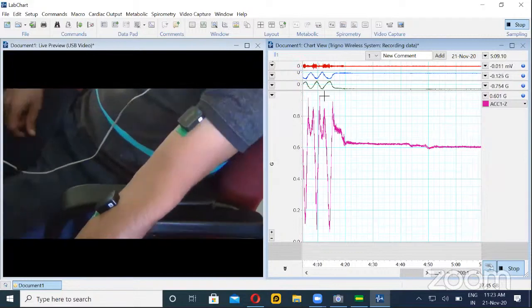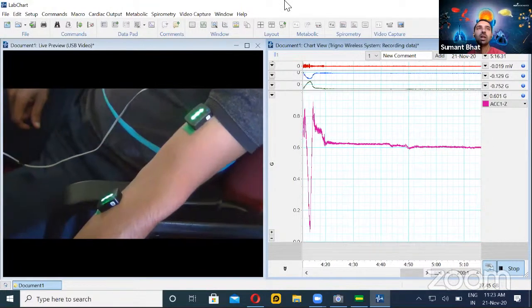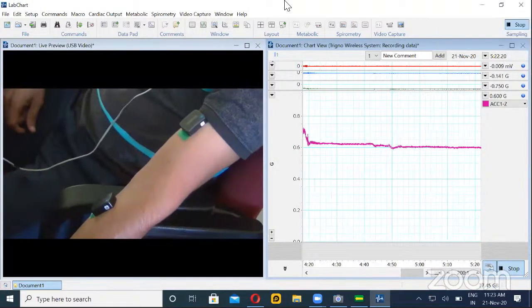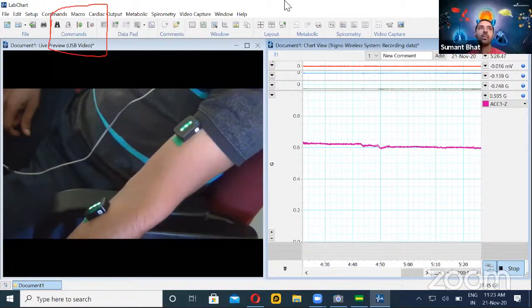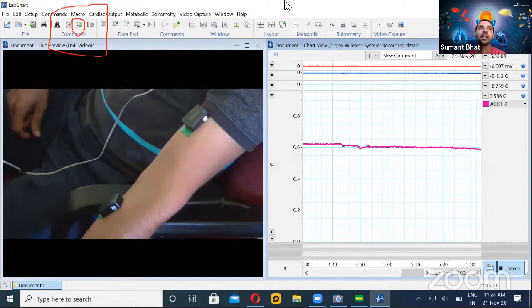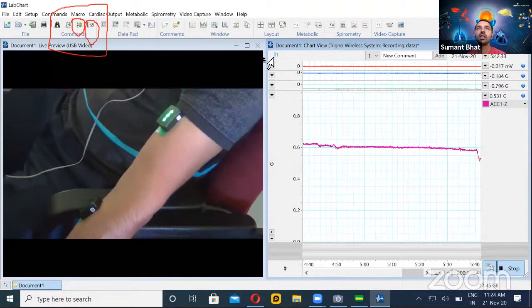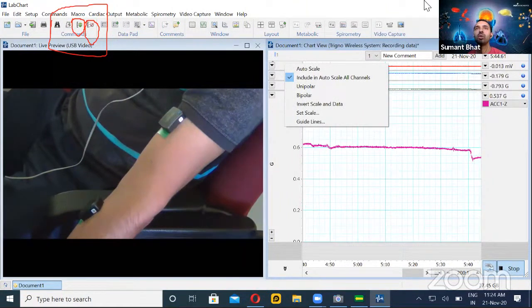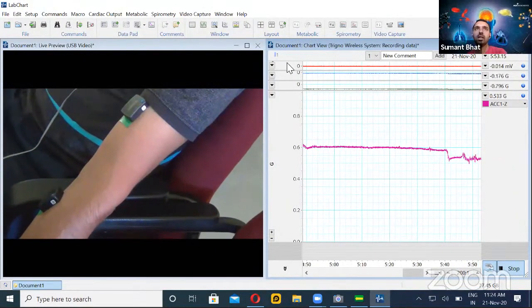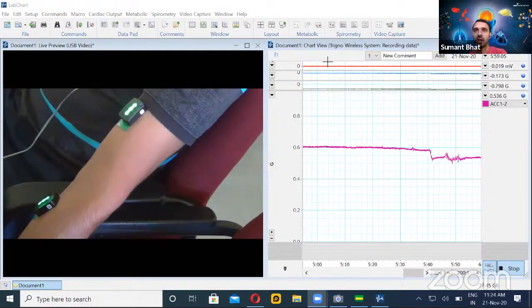There was a question about where the auto scale button is. When you take the cursor to the command section, the first green color icon is the auto scale, and the second one is continuous auto scale. You can also right-click on the channel — if you right-click on the graph itself, you can auto scale that particular channel.